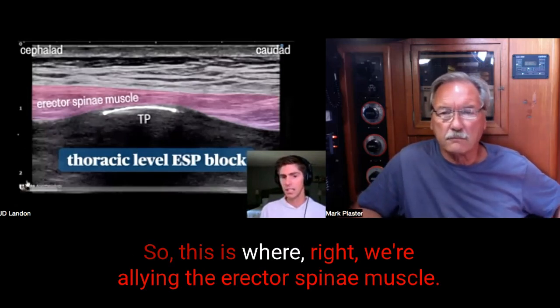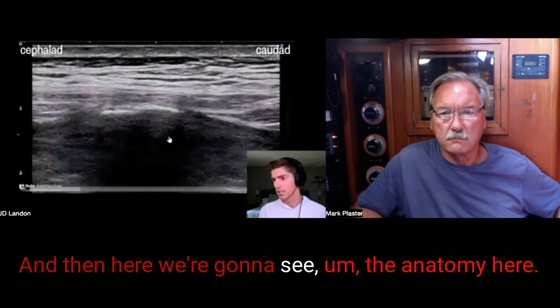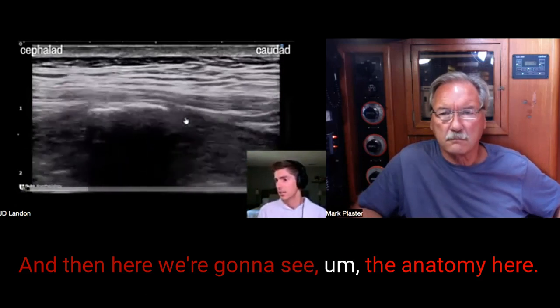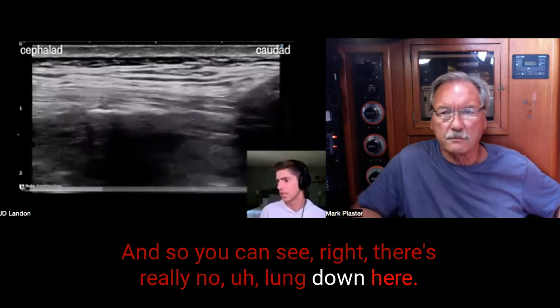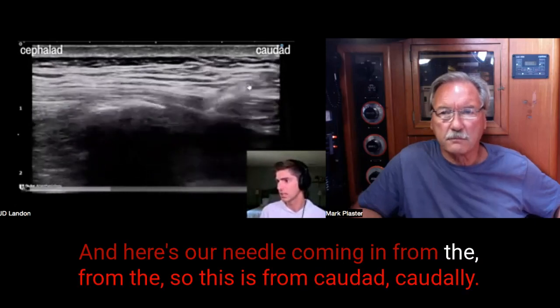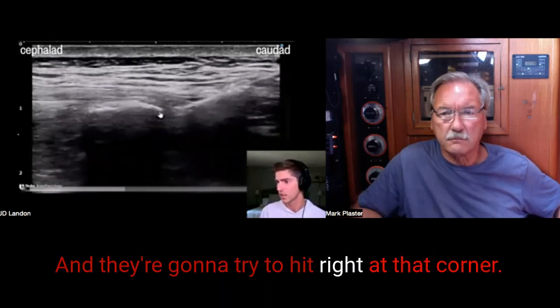So this is where we're outlining the erector spinae muscle. Here's that transverse process we talked about. And then here we're going to see the anatomy. You can see there's really no lung down here, and here's our needle coming in from caudally, and they're going to try to hit right at that corner.